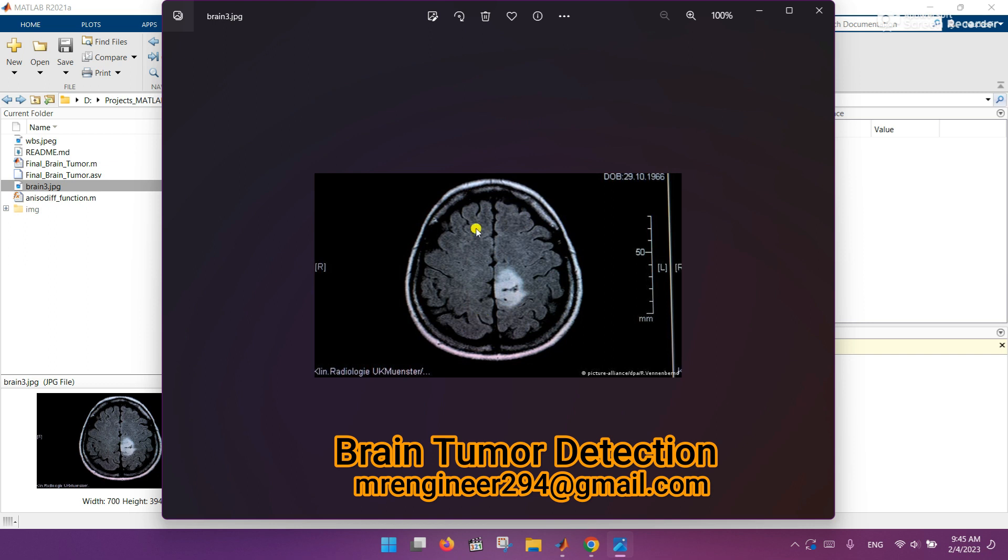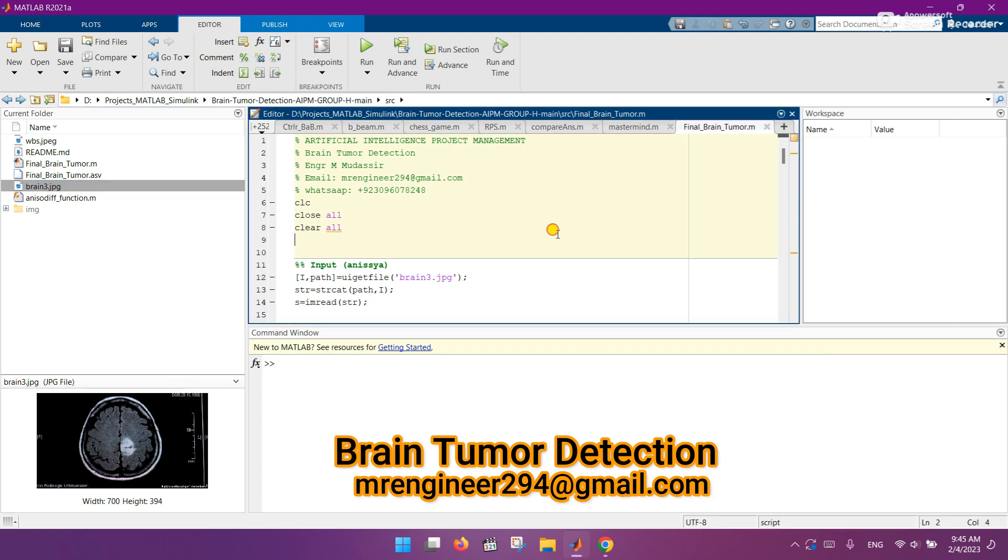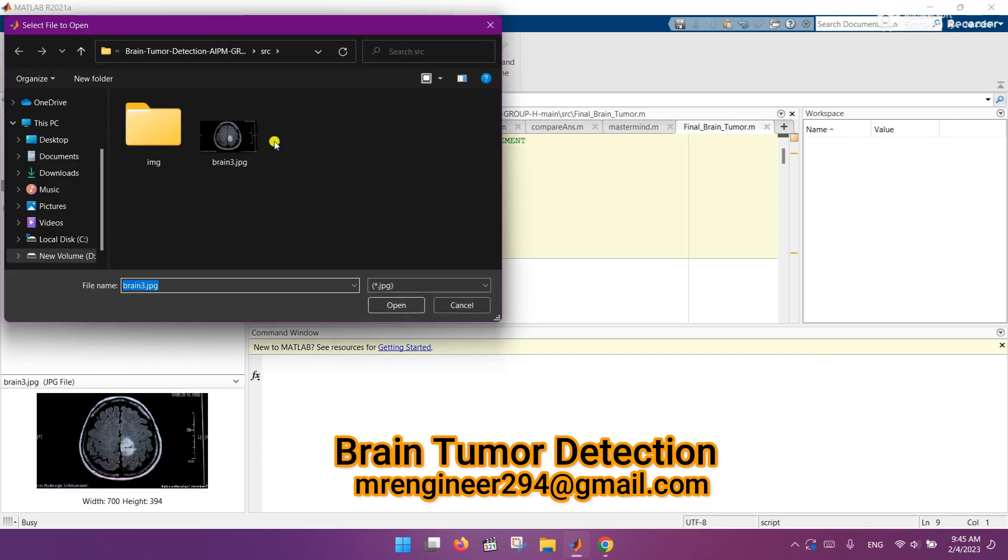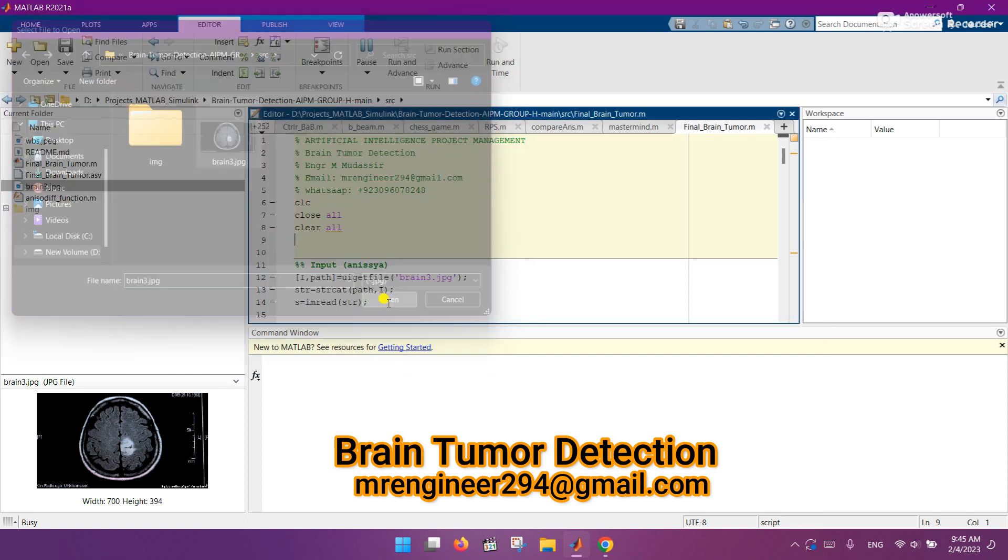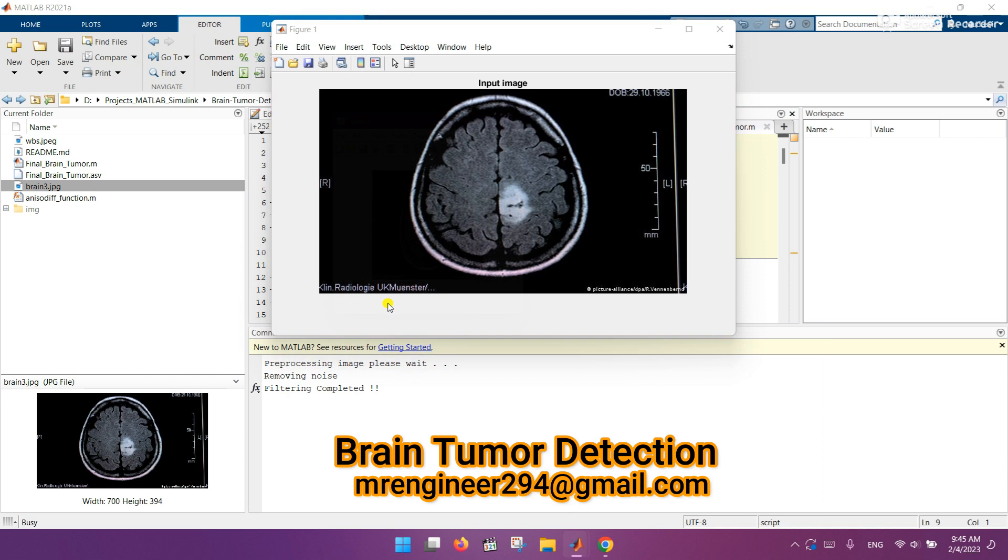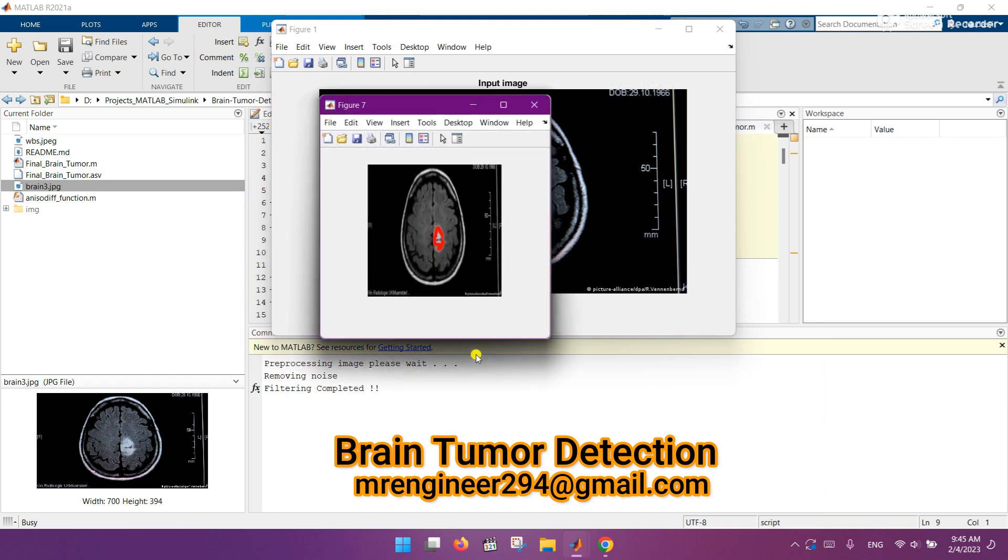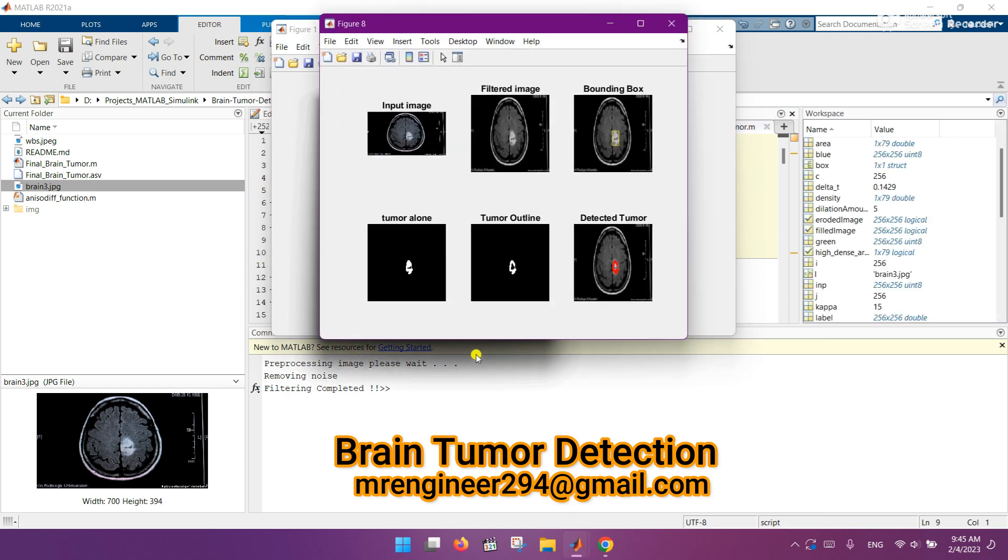So let's see how it works. Let me run the code. Here you can see that it is asking to select the image, so I already selected it and then opened it. You can see that the analysis is going.